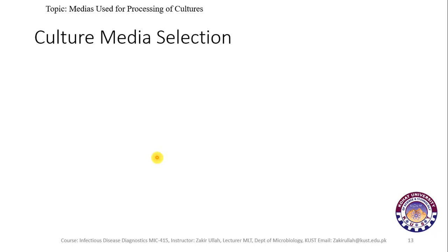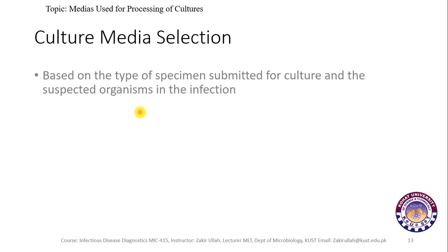The next topic of today's lecture is culture media selection. On the basis of the different specimens submitted to the lab for culture and the suspicion of what kind of microbe is present in a specific specimen, different culture media are selected.